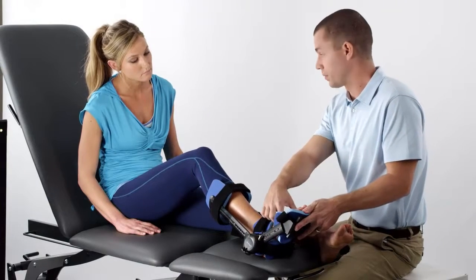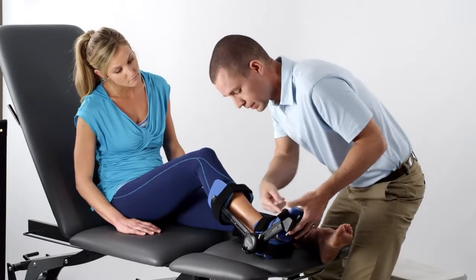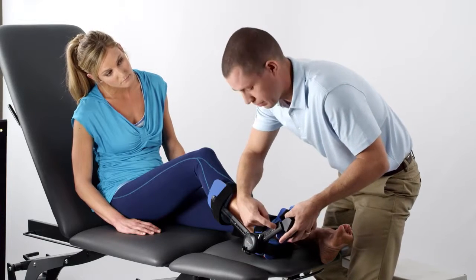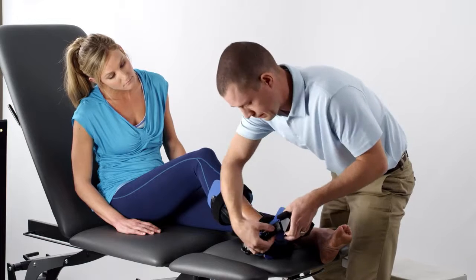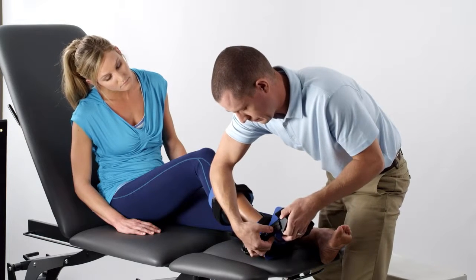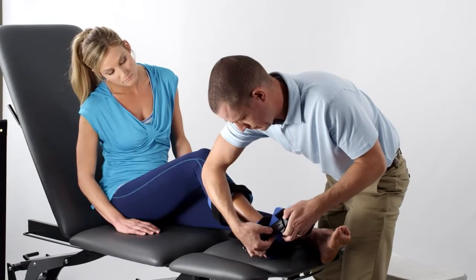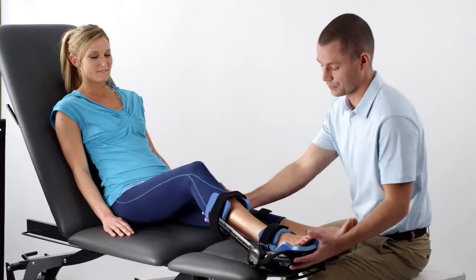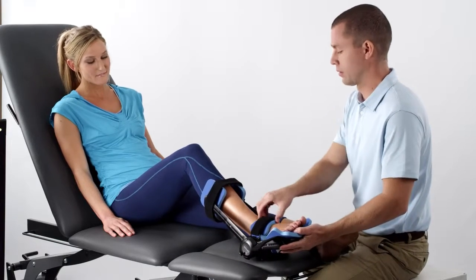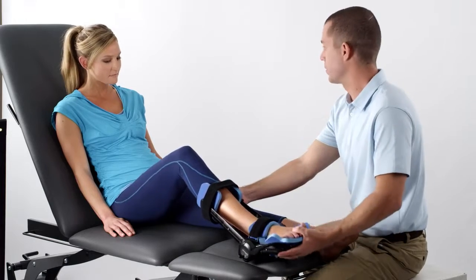You can adjust the position of the foot cradle to accommodate various foot lengths. The ball of the patient's foot should rest on the midpoint of the foot cradle. Depress the leaf pins on the distal struts to lengthen or shorten the foot cradle. The foam pads, foot cradle, and heel cradle must not impede ankle dorsiflexion movement.